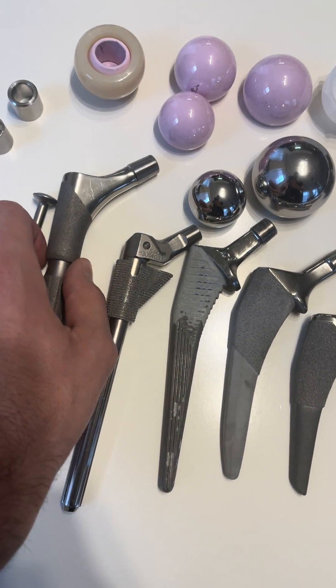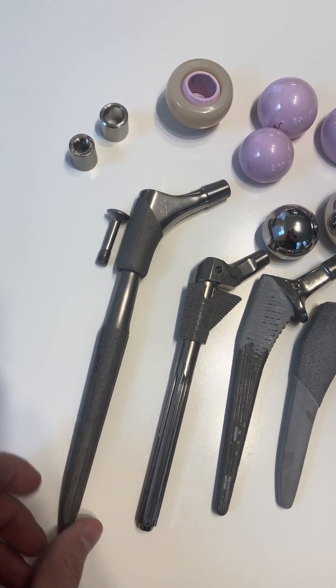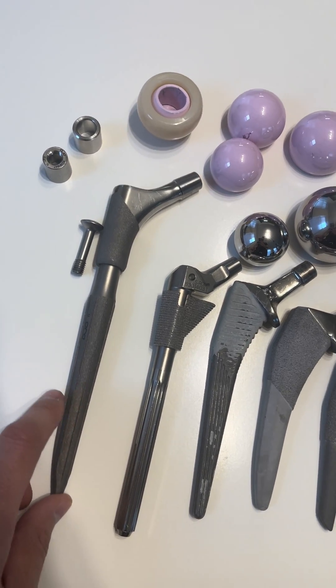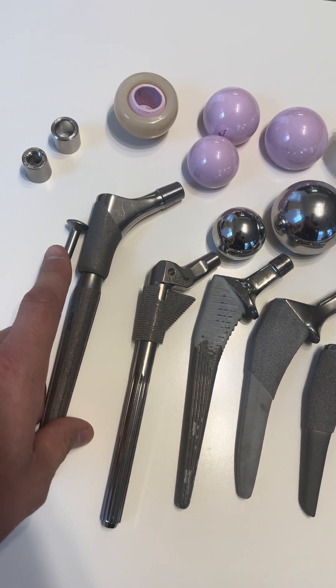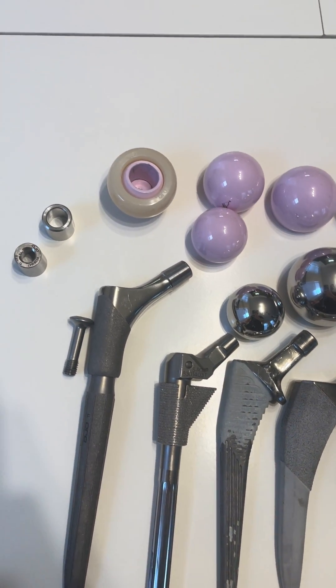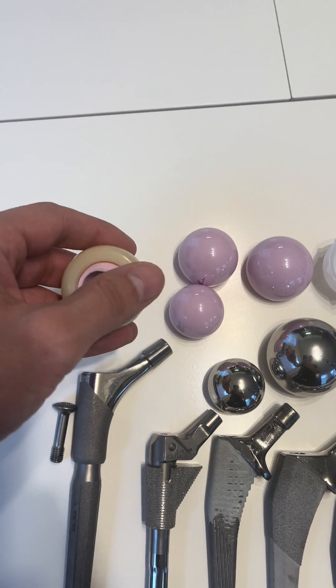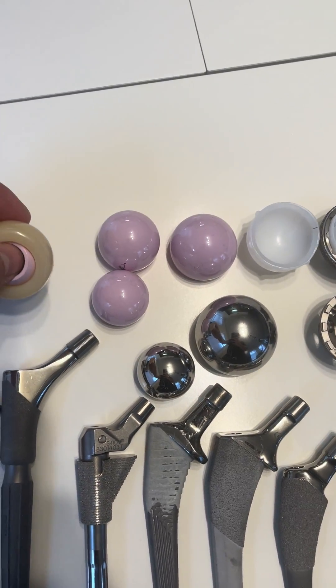This is a modular type revision stem. You can see this actually comes off — you lock this piece into the bone first, and then you attach this piece on top with a screw. For really severe hips that have instability problems, you can use this type of head, which is called a dual mobility. It's a head in a head, which works really well.